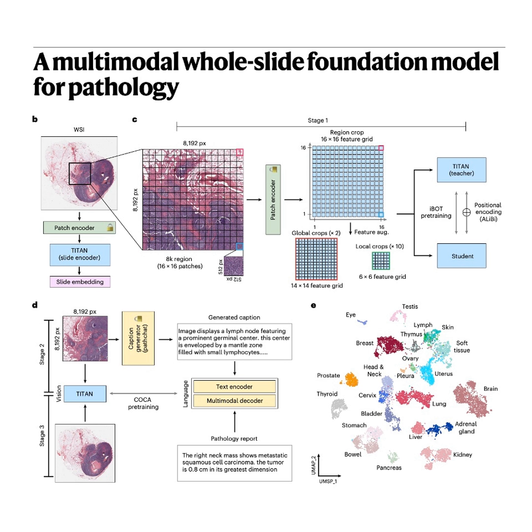And the case study you shared proves the clinical relevance, not just the technical accuracy. Retrieving a query slide for something called a paraganglioma, it successfully returned other paraganglioma slides, but also highly similar pheochromocytoma slides. And that is the ultimate proof of deep learning. Those are two closely related, rare neuroendocrine tumors. Titan didn't just match labels. It recognized the underlying shared morphology, the shared cellular structure. It connected two clinically related diseases. That's so much more useful to a pathologist than just finding an identical image.